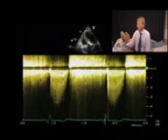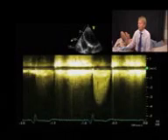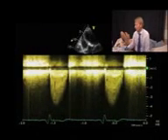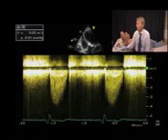So once you have the optimal signal and you think you have the maximum velocity, you freeze the curve, and then we optimize also the time axis. This gives us a higher accuracy when we quantify the gradients, and we look for the beat where we think we have the maximum velocity, and then we perform a trace around the curve, beginning with aortic valve opening.